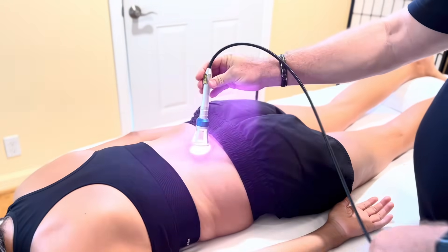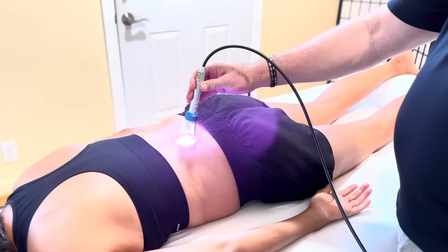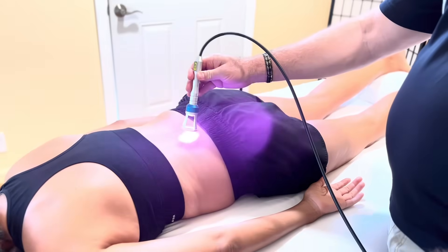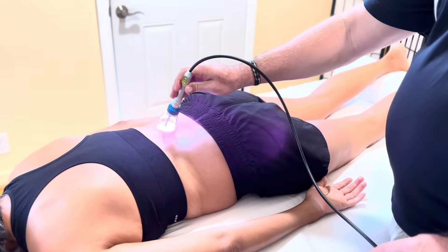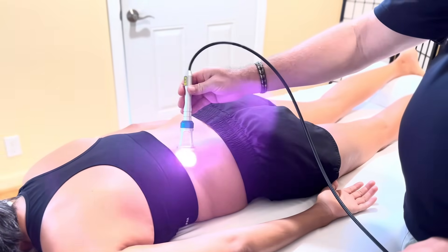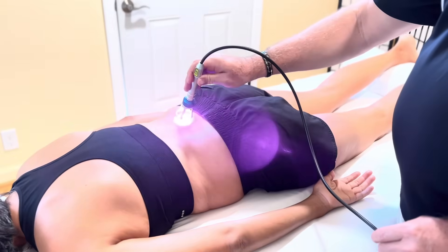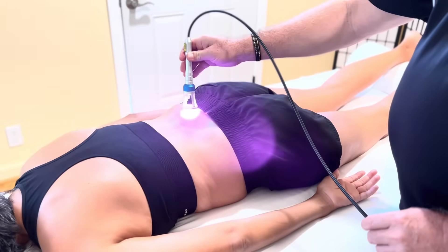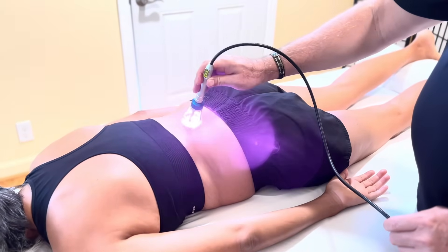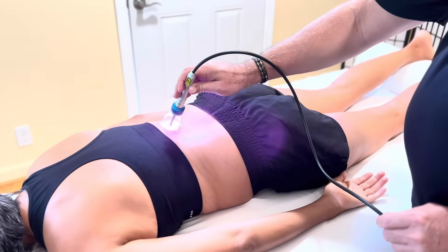Now it says Ready, and we take the laser and apply it to the patient's body. I push this switch, and you can hear the beeping sound — immediately after that beeping sound, heat is coming out of the laser. Do you feel the heat? Yes. It's a nice gentle warming heat. In order to not excessively heat the tissue, we just keep the laser emitter moving slowly but continuously.